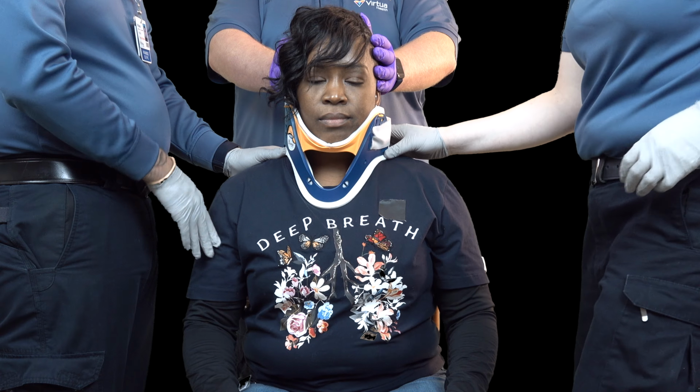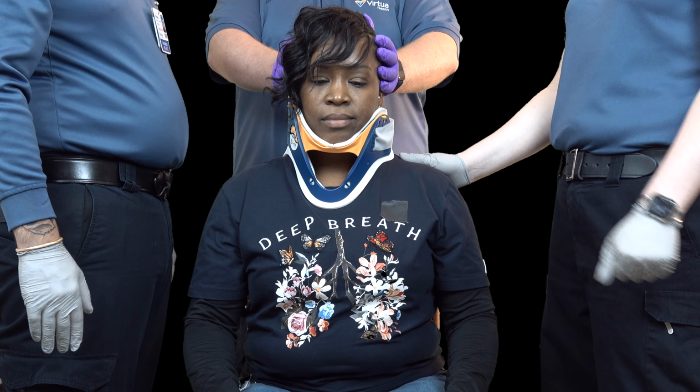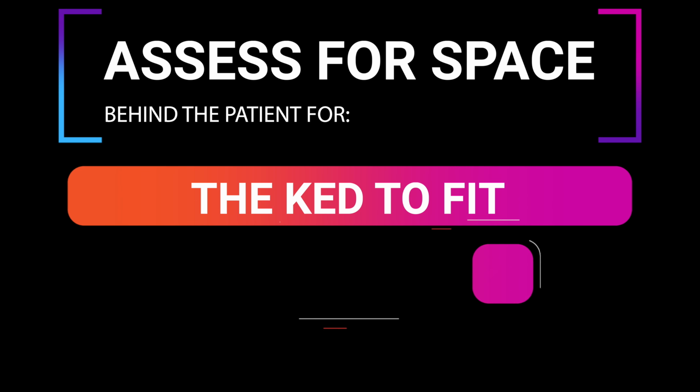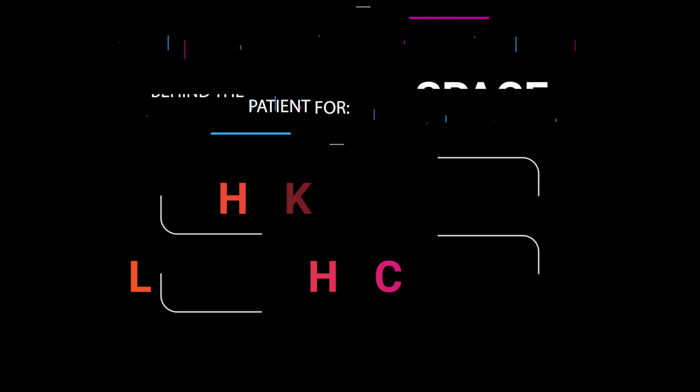Ask your patient to do their best to remain seated in this position. If possible, they could place their hands on the steering wheel to assist themselves. Make sure that you have enough room behind the patient for the KED to fit. This can usually be accomplished by lowering the back of the patient's seat.